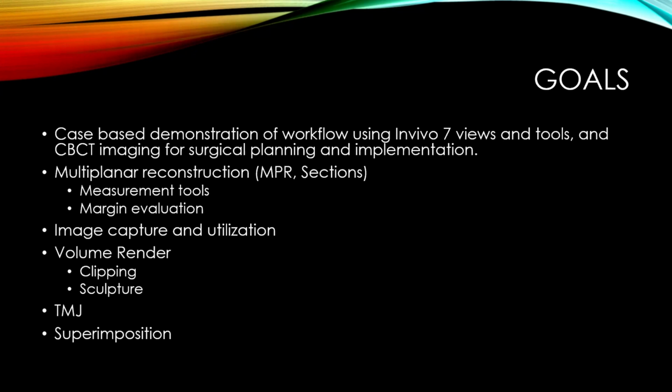And then if we have time, we'll play with the superimposition tool a little bit, which is kind of fun if you have before and after scans, and you can really superimpose them and see what everything looks like.